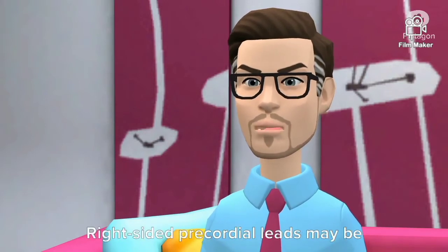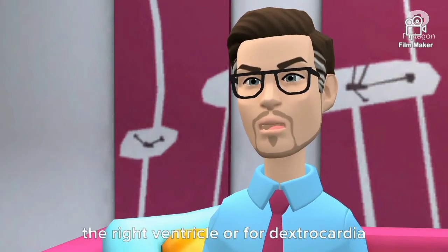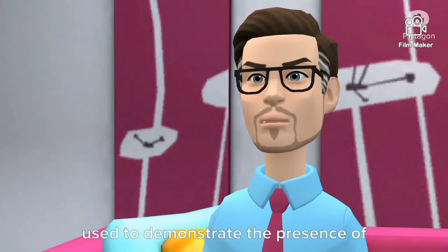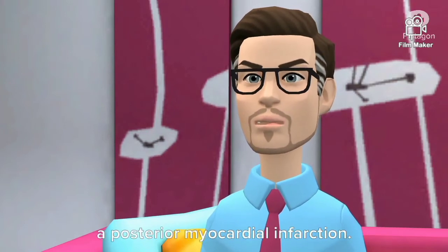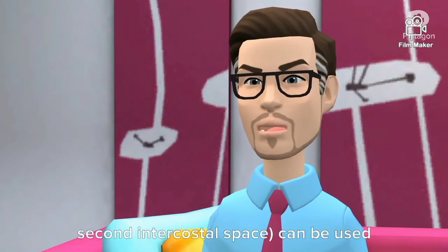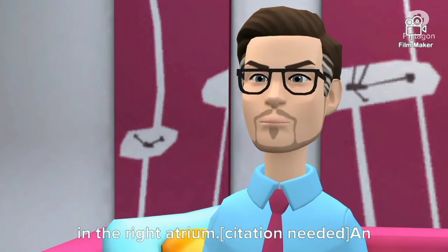Right-sided precordial leads may be used to better study pathology of the right ventricle or for dextrocardia and are denoted with an R, e.g., V5R. Posterior leads V7 to V9 may be used to demonstrate the presence of a posterior myocardial infarction. A Lewis lead, requiring an electrode at the right sternal border in the second intercostal space, can be used to study pathological rhythms arising in the right atrium.